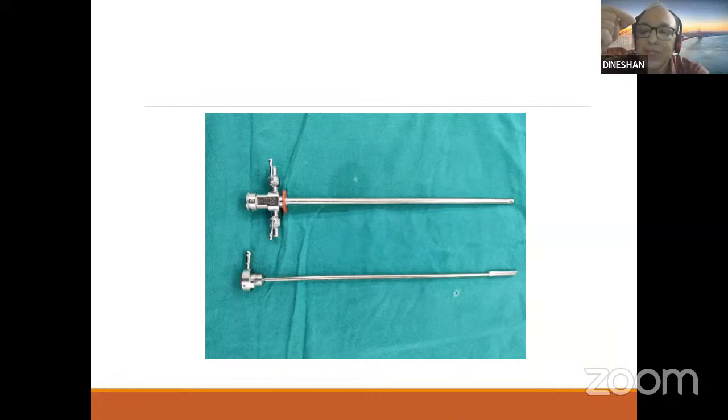The disadvantage of the longer beak is that when you are doing a female cystoscopy, the female urethra, as you know, is very short. So when you enter the urethra, the fluid will come outside through the beak, and the urethra will not get distended.